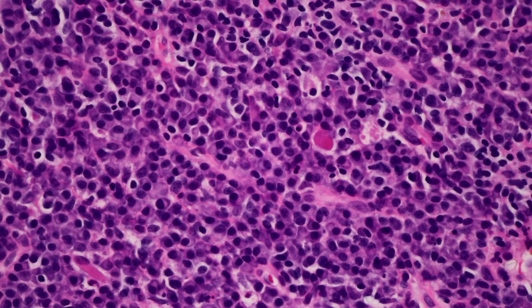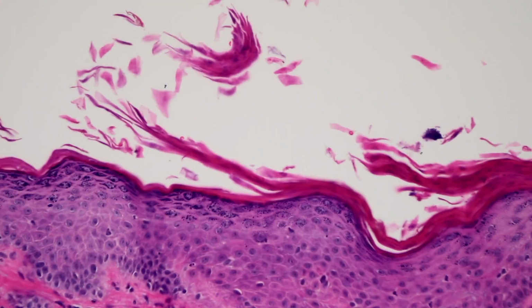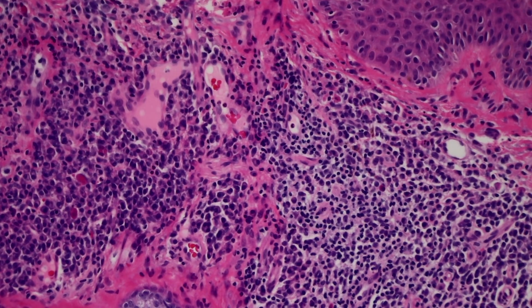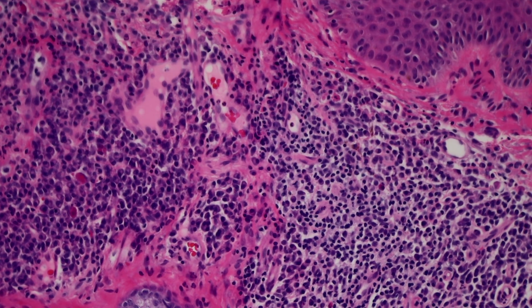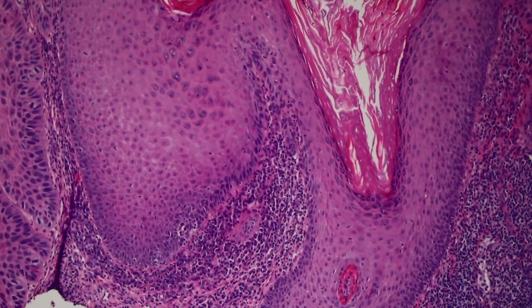So again, I don't usually go doing kappa and lambda stains or anything like that. I just see this all the time: tons of sheets of plasma cells underneath a lesion. And I also see a lot of inflammation, but that said, if you see a bunch of lymphocytic inflammation under a squame, that's a common finding. But if they happen to look very uniform and round, I have seen a handful of times where there was chronic lymphocytic leukemia or small lymphocytic lymphoma, CLL, SLL, adjacent to squamous cell carcinoma. And I've seen some cases where the squame behaved very aggressively clinically because the patient had undiagnosed CLL and it was basically wiping out their immune system. And so the squame was kind of running uncontrolled, almost like the patient had had a transplant.